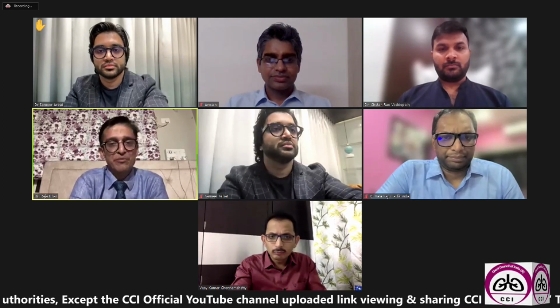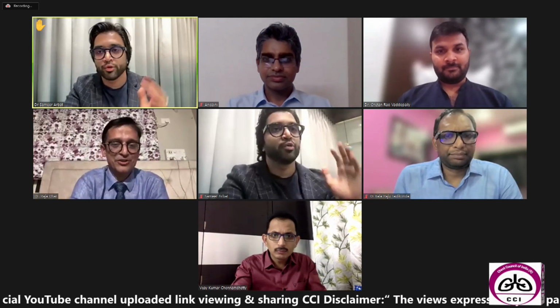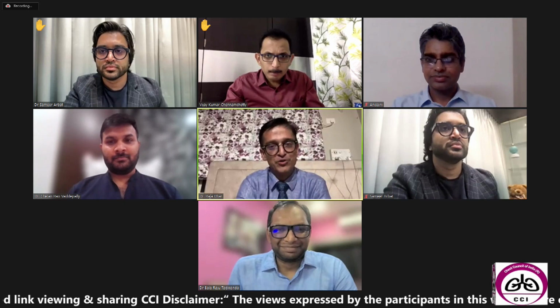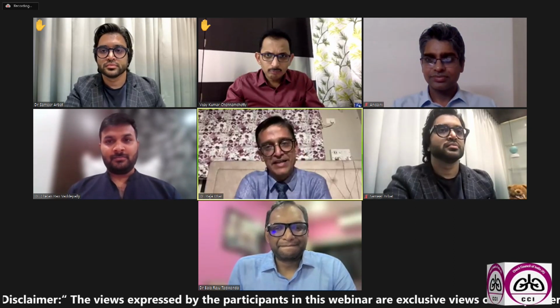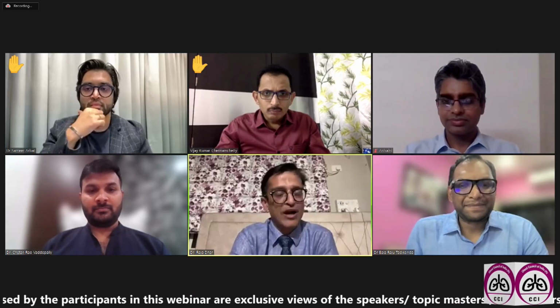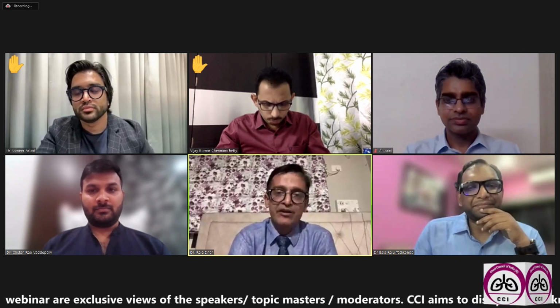Right. So, Samir, one question before we try and summarize this. Are you using the disposable probes? Yes. Right now, I don't have the older probes. I only have the disposable. So I have to put up my hand and say that if I had to use the disposable probes, I probably would never have learned doing cryo. I think it would be prohibitively expensive. I don't know about the rest on this panel, but I think very few centers would manage to afford using a disposable probe in India today. I'm fortunate enough to have two cryo units and a couple of reusable probes that are still with me. And I think it'll be difficult for the developing world to use disposable probes unless we start preparing them locally at a much cheaper cost. We are facing a very big problem that the company has a monopoly on this particular modality.